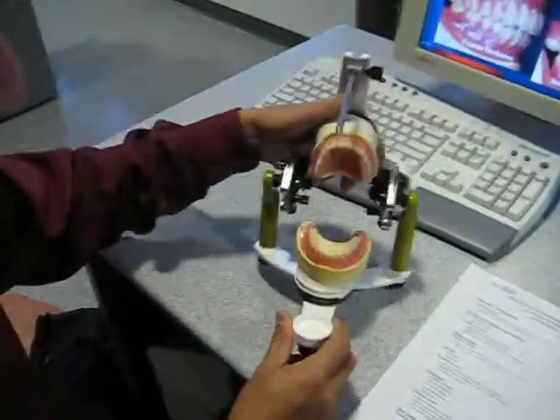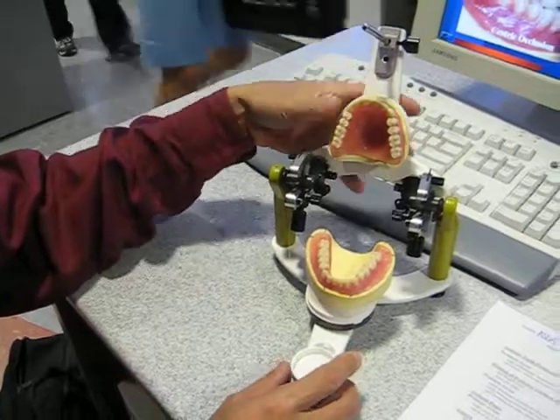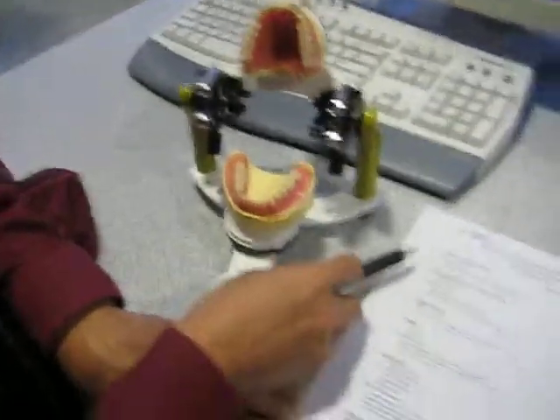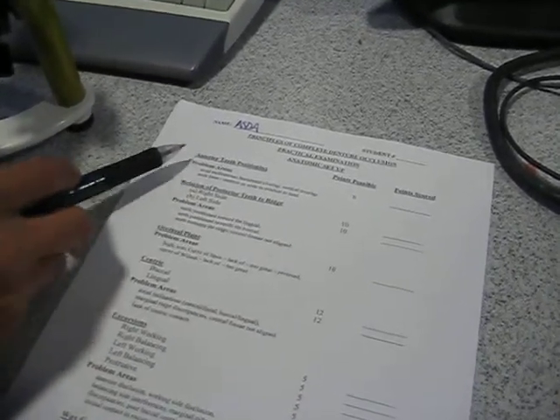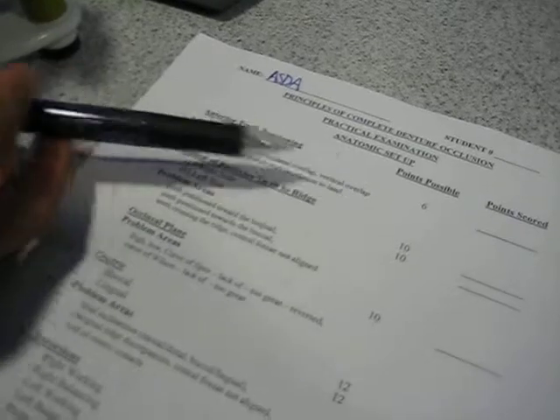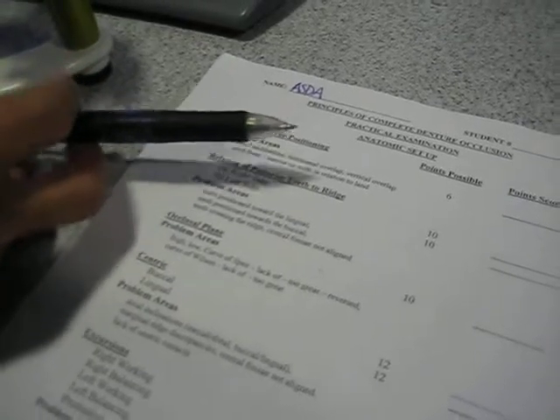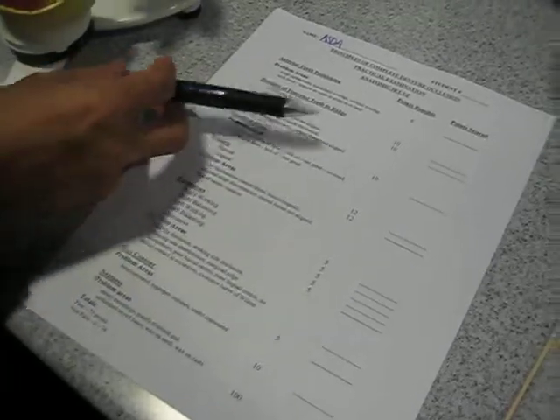Okay, we're going through the grading procedure for a complete denture, wax trial denture setup. And as you can see on the grade sheet here, we start out with anterior tooth position because it sets up the relationship of the posterior teeth. And even though the points possible on the anterior teeth amount to only 6 points, everything at the top of the sheet tends to affect the results you're able to produce in the lower part of the sheet.